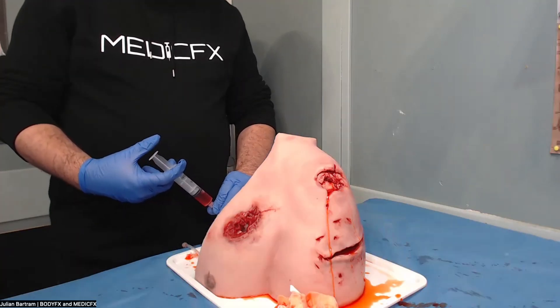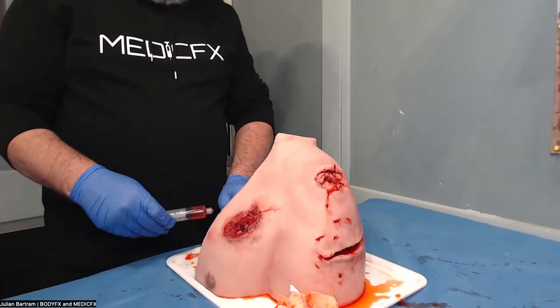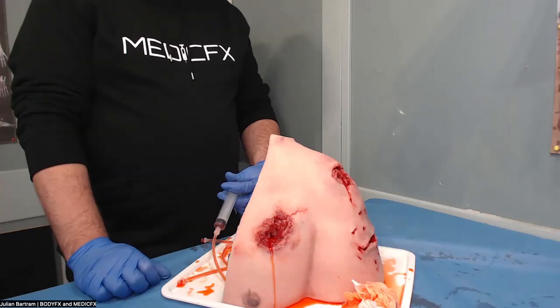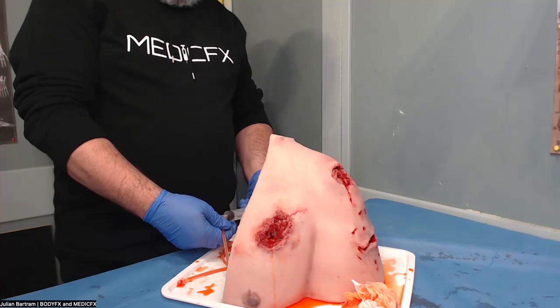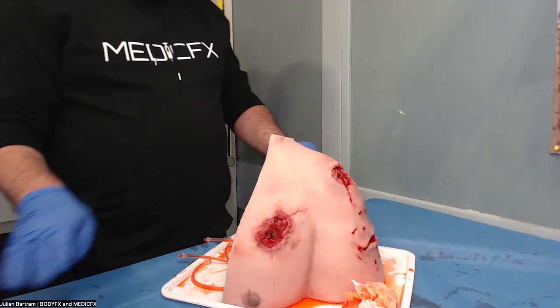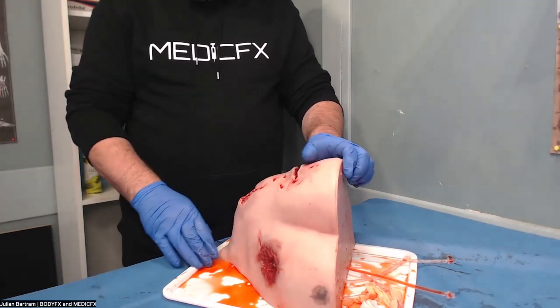These can also be hooked up for a gravity feed as well, so you can have it consistently bleeding if you like, meaning that the instructor can also be hands-free. This model has been designed so that you can either use it in the upright position or with your patient laying lateral as well.